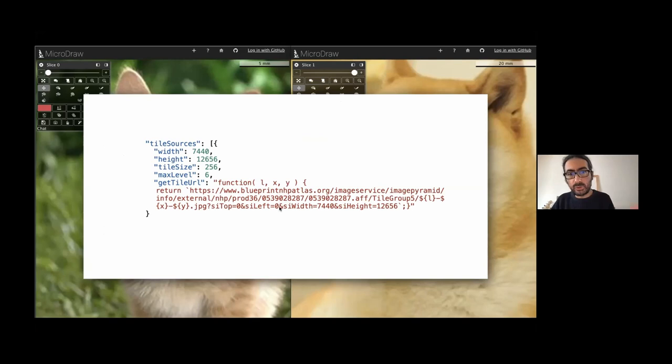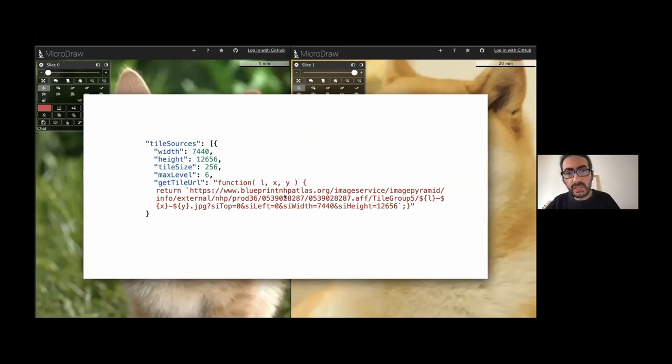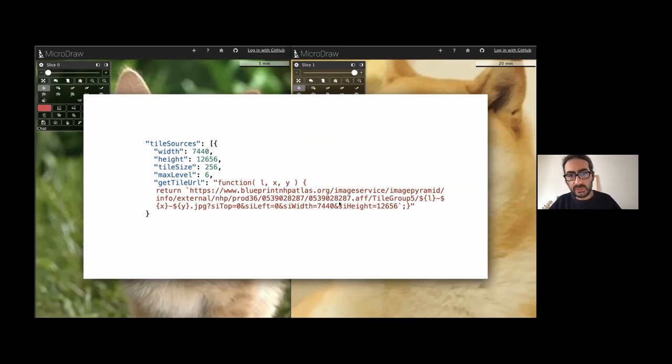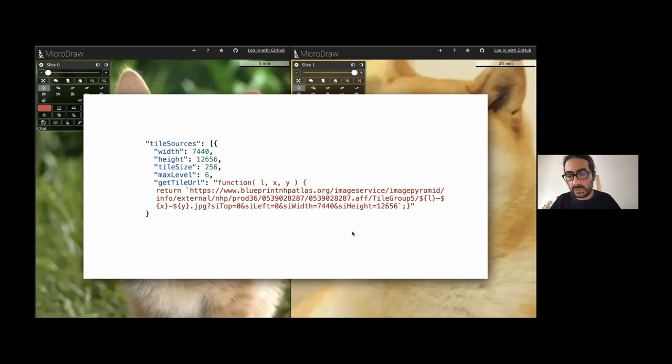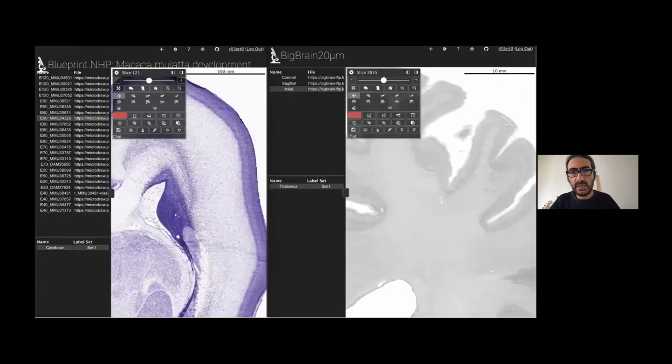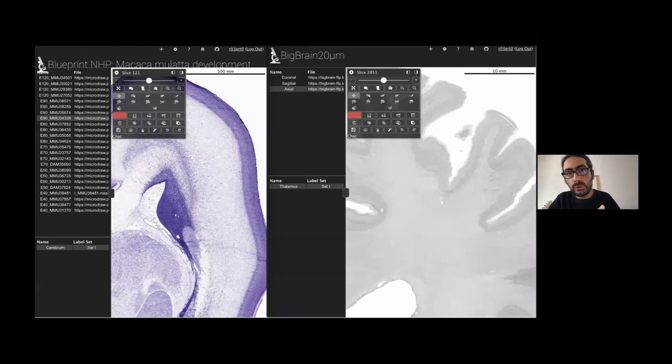This example shows how you can get data from the Blueprint, a non-human primate atlas. It's just a matter of finding out what's the way in which they sort out their tiles. And then you write a small json file and no need for downloading anything. You are immediately working on this data. So all this data is available already to you through the MicroDraw interface.